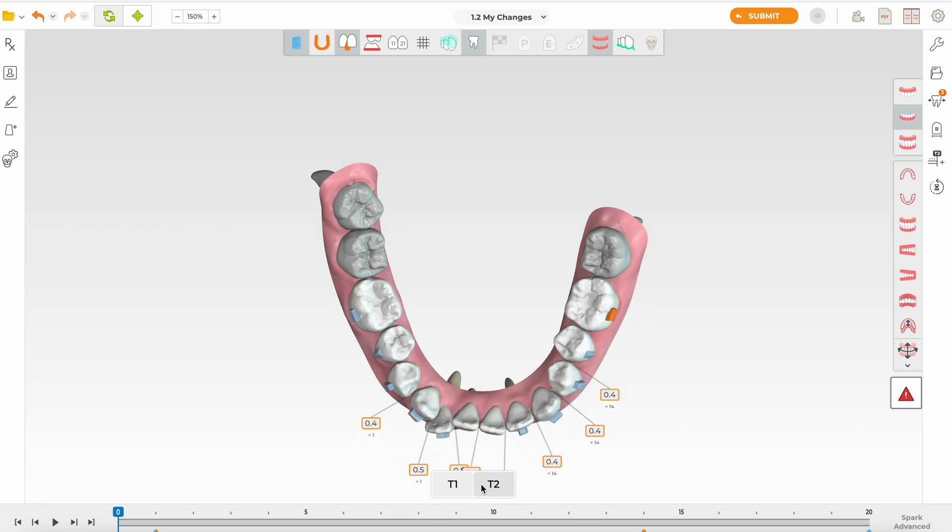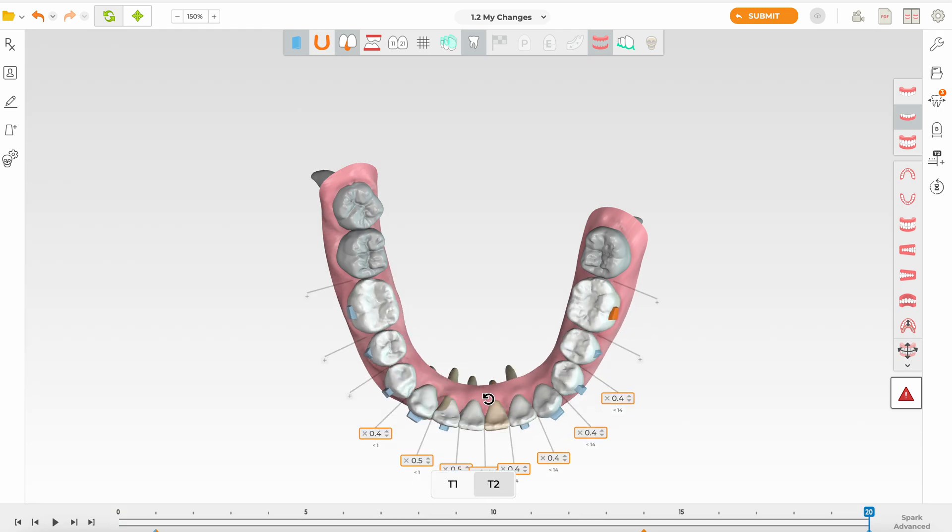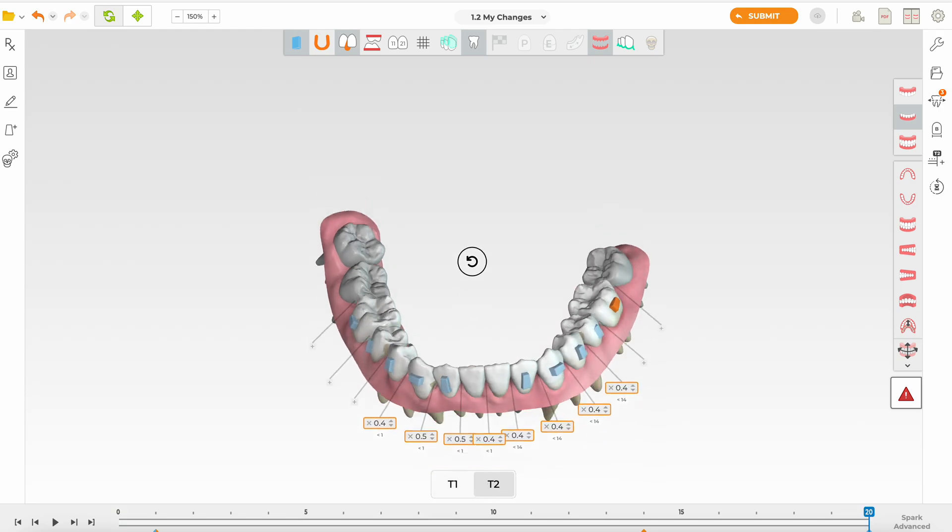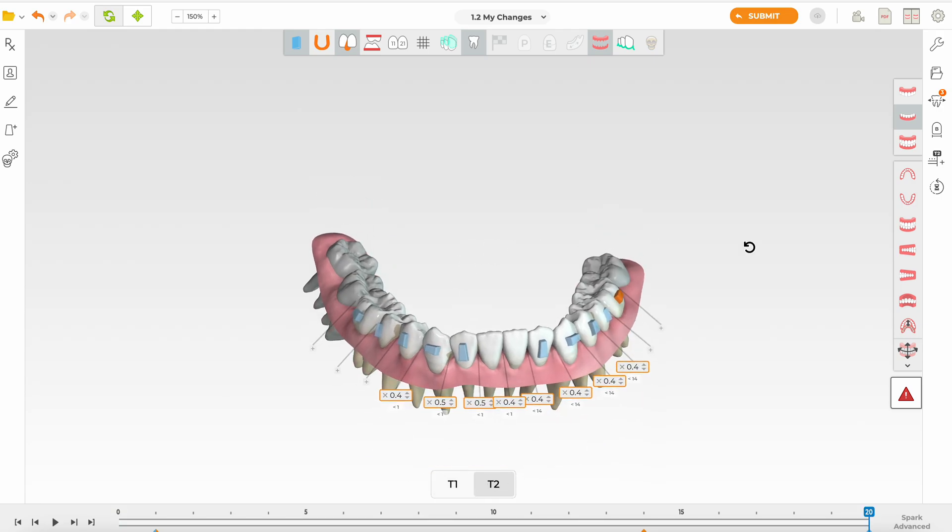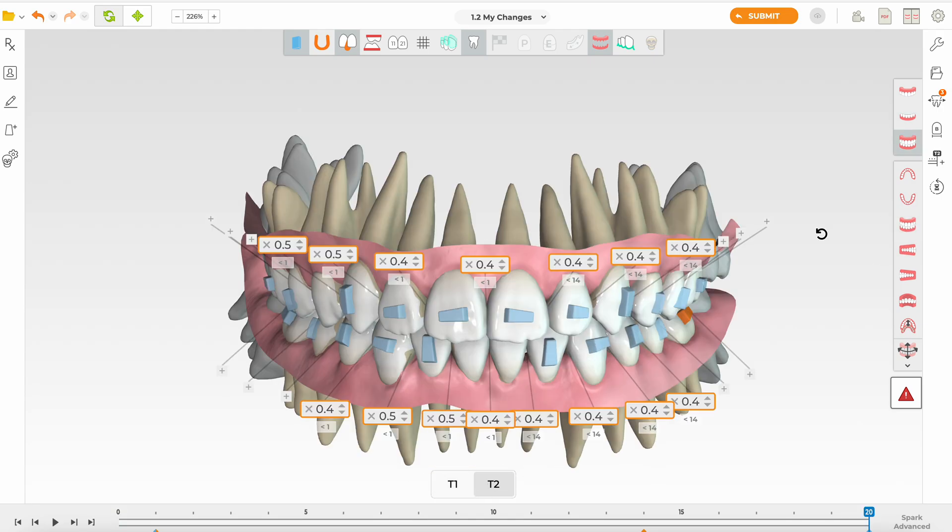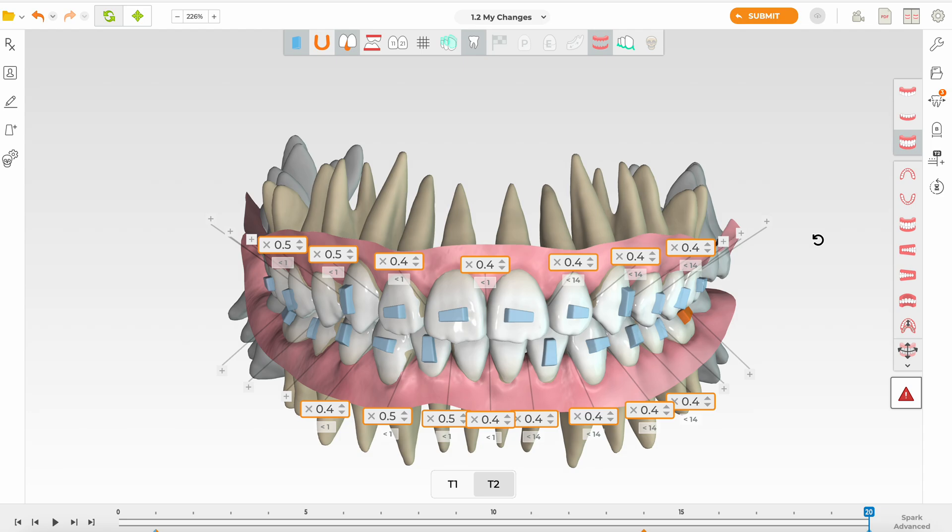They're actually going almost back a bit because of the IPR. So in my opinion the IPR should be more distributed across your anterior teeth. It's easier to IPR anterior teeth over posterior and you're spreading it across a few teeth, it makes sense.